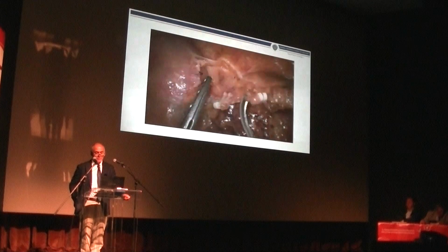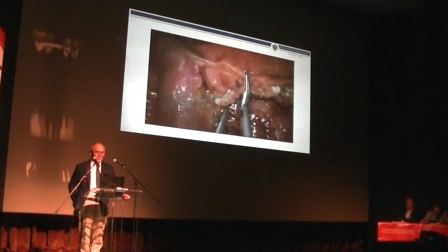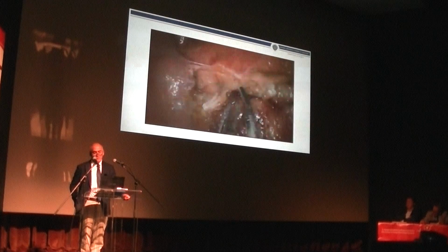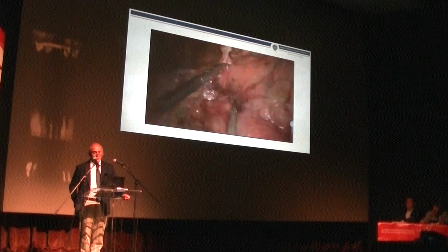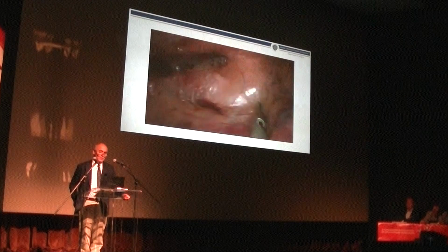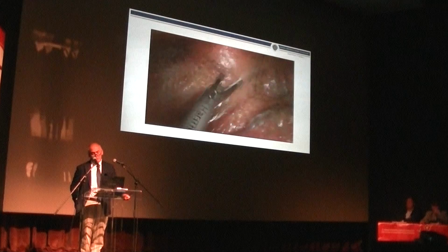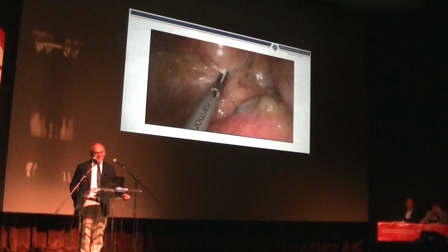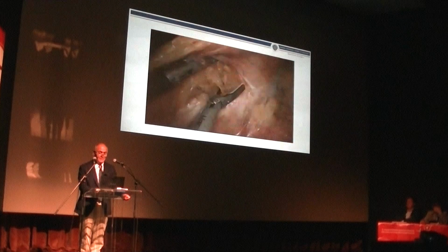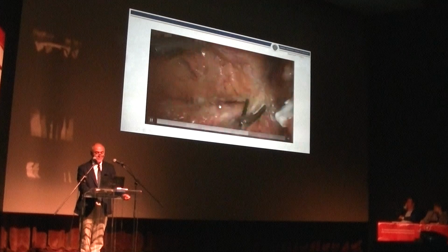Just divide the inferior mesenteric vein, and then incise the posterior sheet of the visceral transverse mesocolon at the superior border of the pancreas. This allows us to go inside to the bursa omentalis. This is the superior border of the pancreas. The pancreas can be delineated and encountered here nicely.